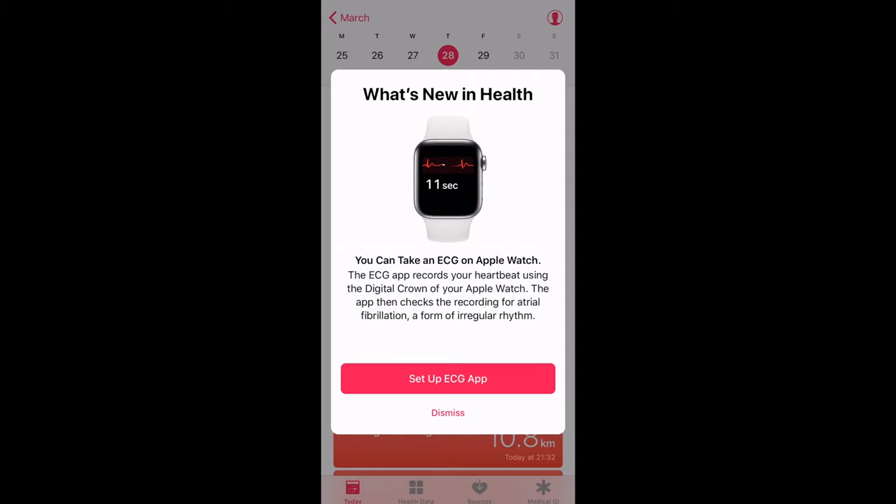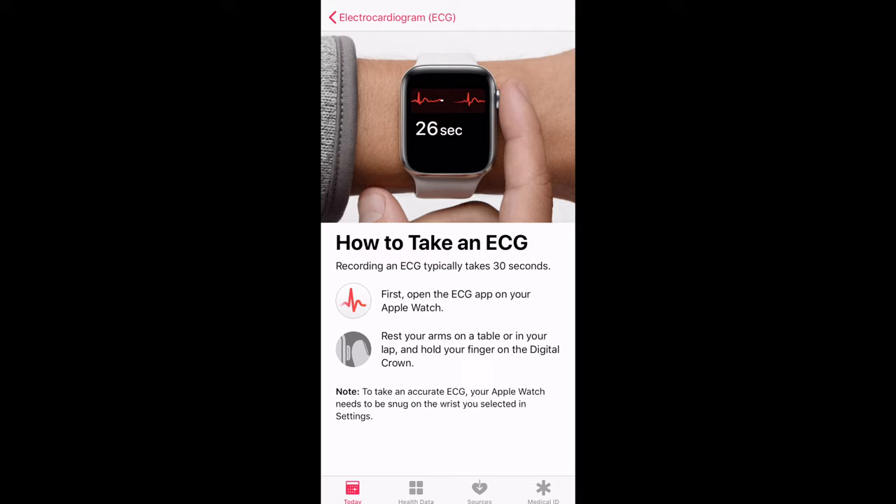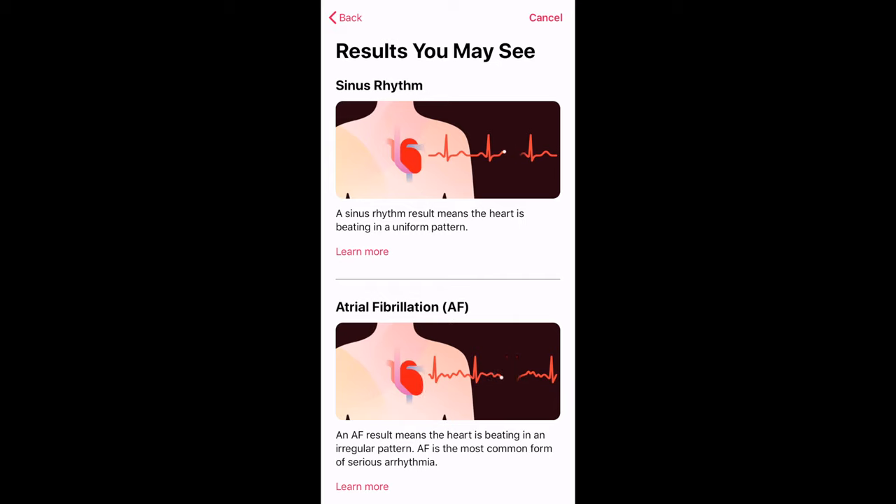Here in the UK, we have actually only just got access to the ECG feature. Previously this was only available in the US. I'm going to be setting it up on my Apple Watch Series 4. First we have a look at how to take an ECG on the health app on the iPhone, and then it goes on to show how does the ECG app work, with some instructions to go through, and the different types of ECG results.